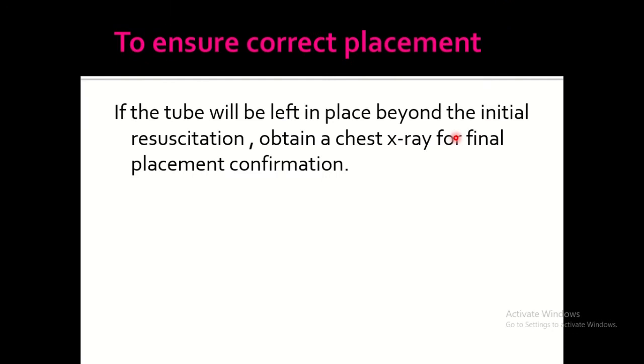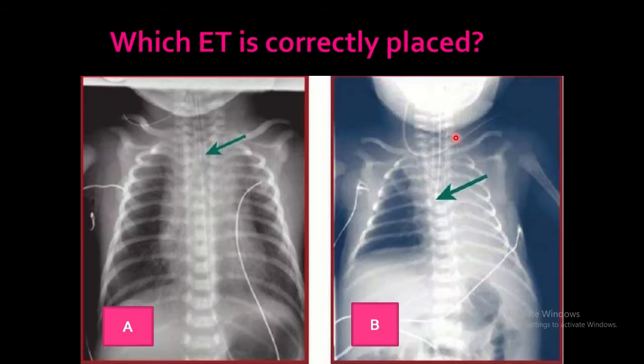How do we ensure it is correctly placed? Absolutely, you should obtain a chest X-ray for final confirmation. As we see in those two pictures, what do you think? Which one is correctly inserted, A or B? Absolutely, it would be A.